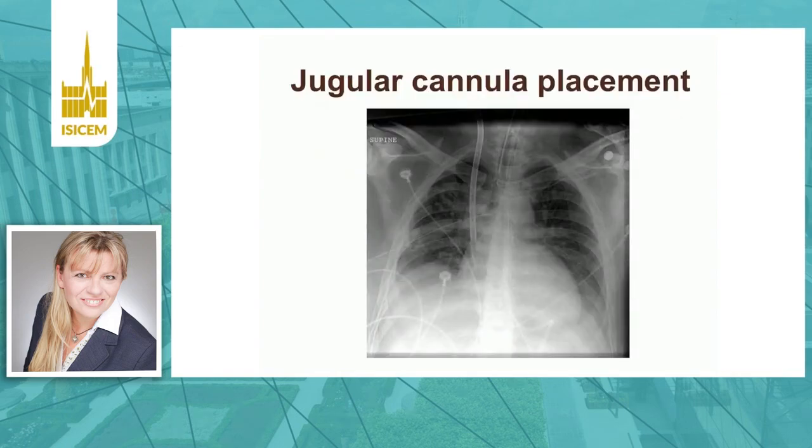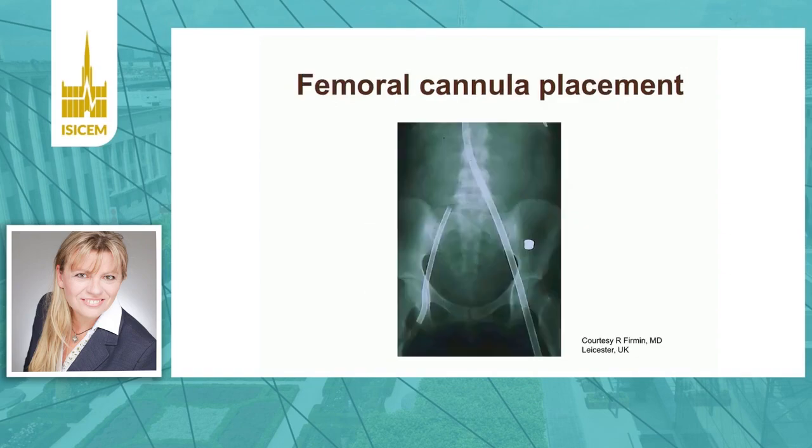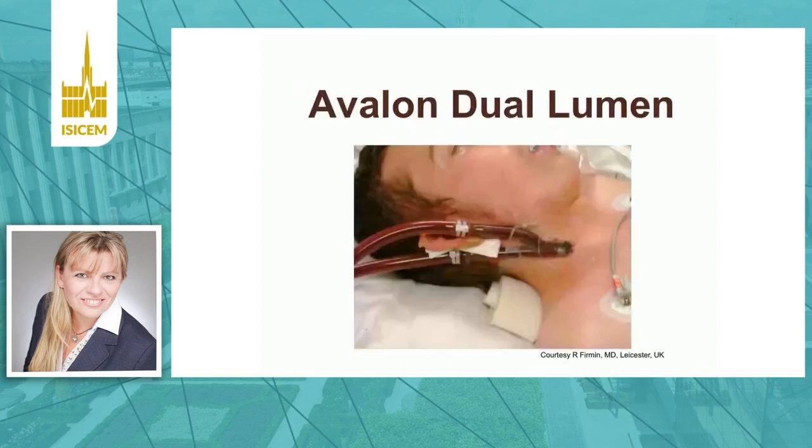This is a picture of how the jugular cannula placement looks in an X-ray picture, and femoral cannula placement for dual femoral cannulation. And this is how the Avalon dual lumen cannula looks when placed in the patient.